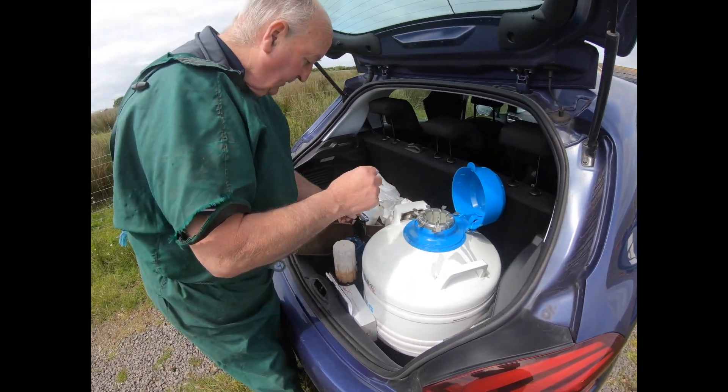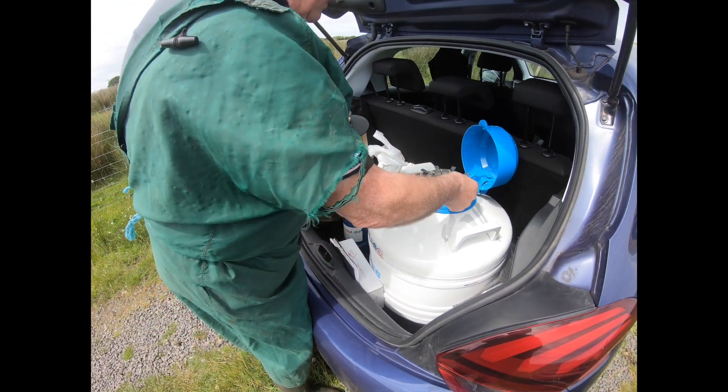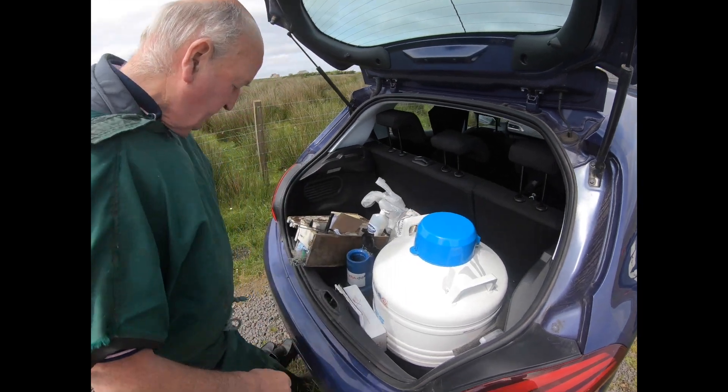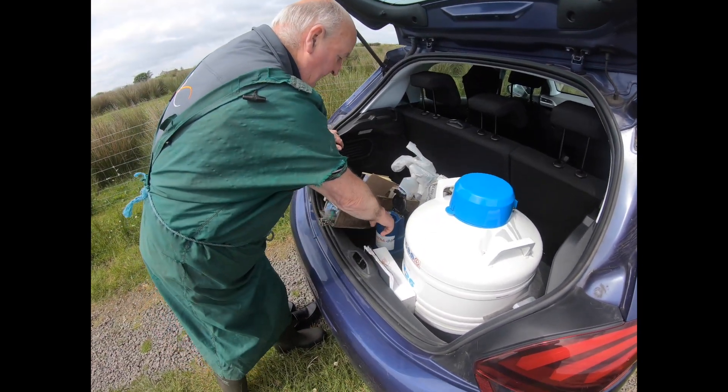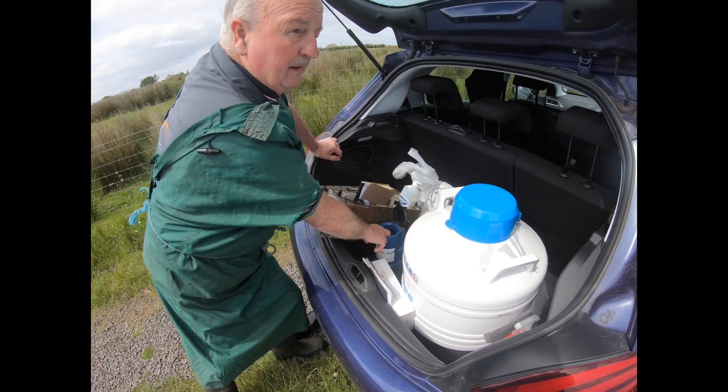So what we do first of all, we put it right into the warm water there, and that thaws the semen out. The semen's in here, in the straw, and now it's thawing out. It'll thaw out quite rapidly within 30 seconds.